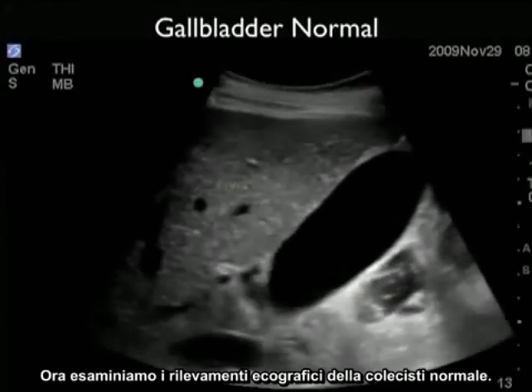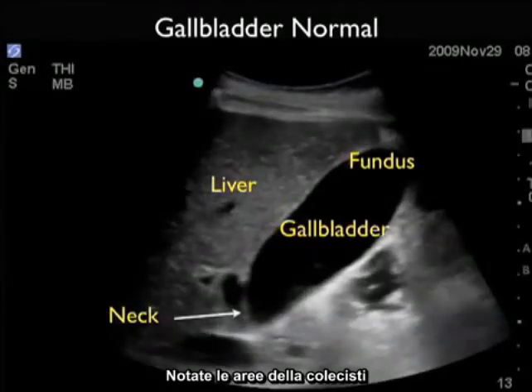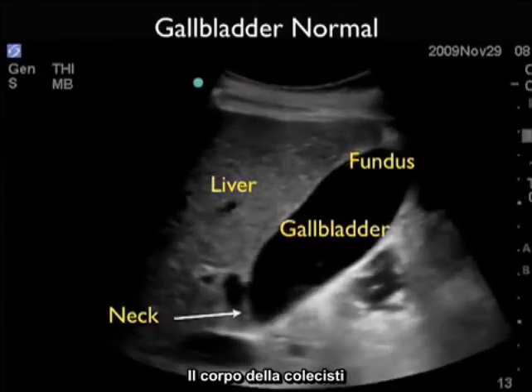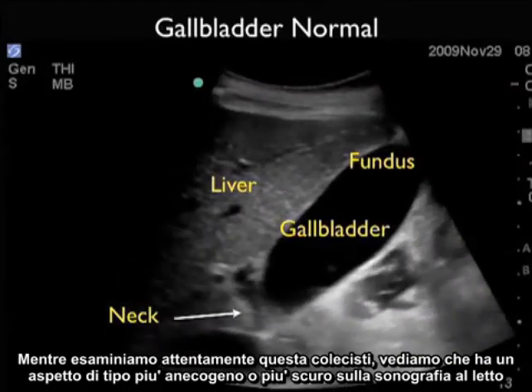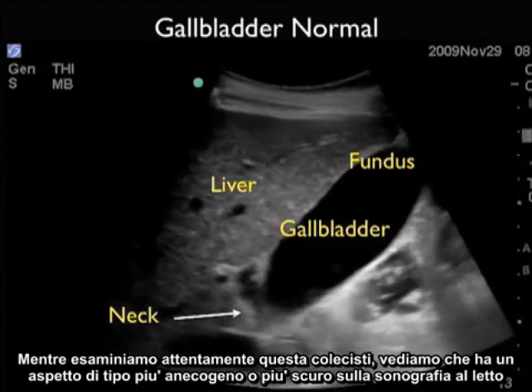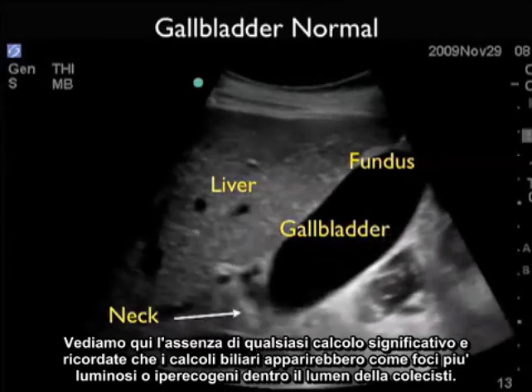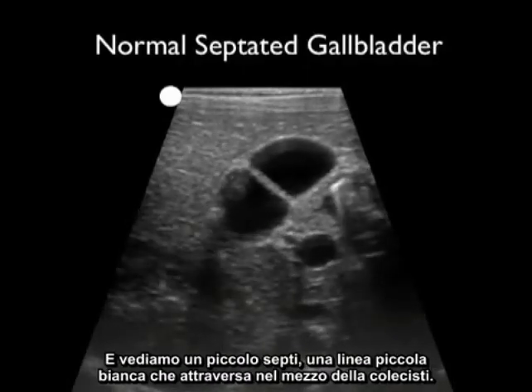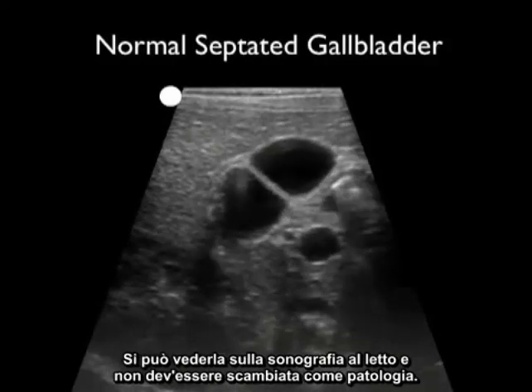Now let's look at the ultrasound findings of a normal gallbladder. We see the liver to the left and the gallbladder just inferior to the liver to the right. Notice the areas: the upper fundus towards the upper right, the body of the gallbladder in the intermediate part, and the neck of the gallbladder towards the left of the image. The gallbladder has a typical darker or anechoic appearance on bedside sonography because of the bile fluid within it. We see the absence of any significant stones — gallstones would appear as brighter or hyperechoic foci within the gallbladder lumen. Here's a normal variant known as a septated gallbladder, with a small septal white line through the middle — this is not to be mistaken as pathology.